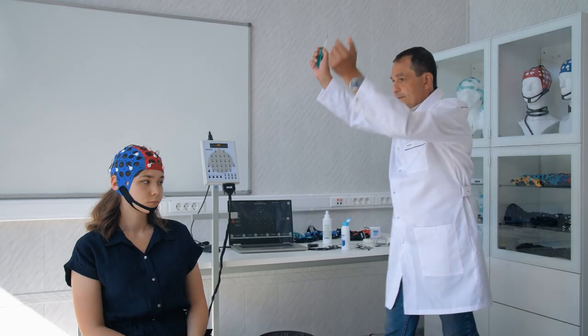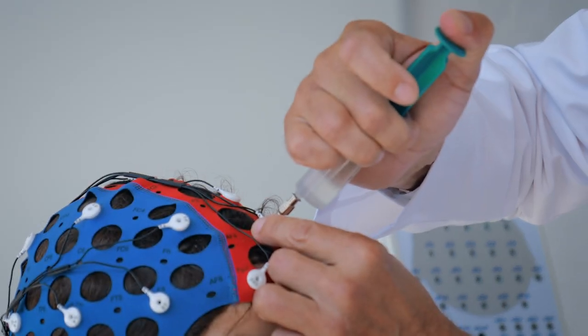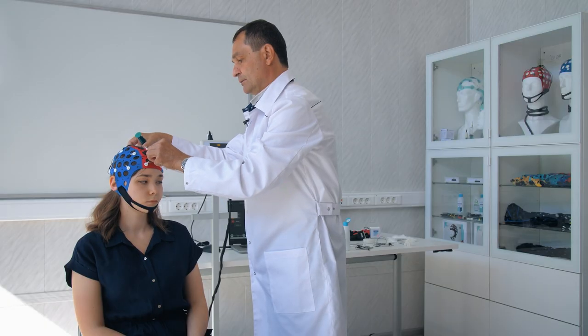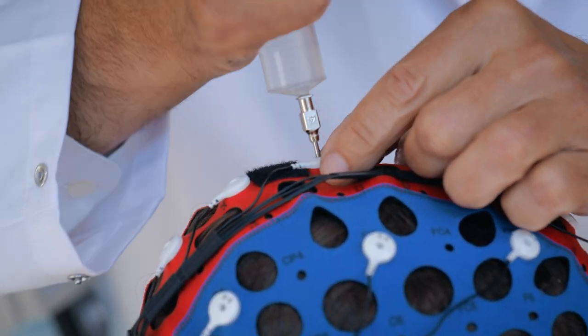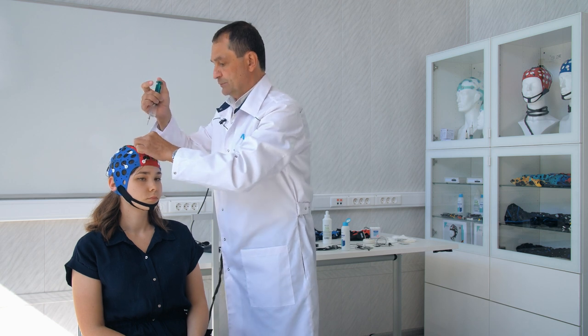Our primary goal is to achieve the lowest possible inter-electrode impedance. It is of utmost importance not to overdose the gel, as doing so can lead to the gel spreading, closing the electrodes, causing shunts to appear, and consequently negatively impacting the quality and accuracy of the recording.